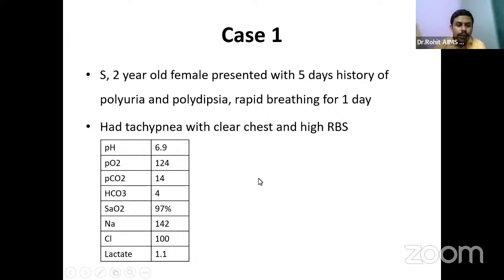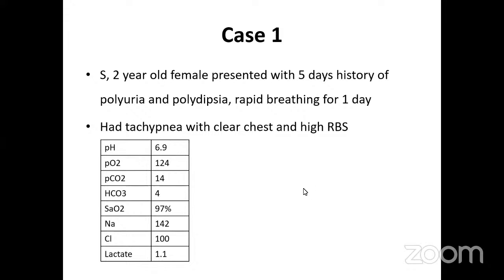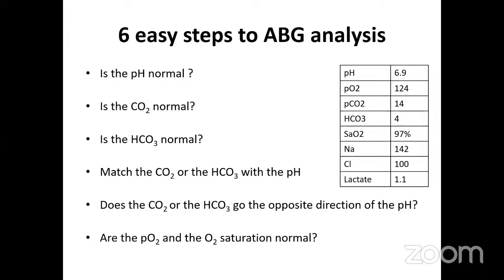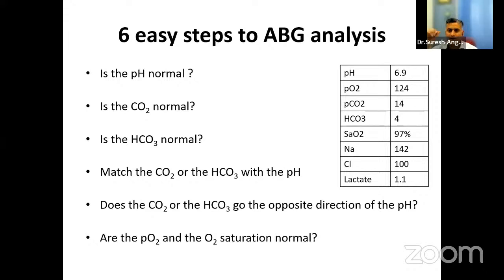Someone says severe metabolic acidosis, from Shubhasi Saldar. Okay, all right. Metabolic acidosis with respiratory compensation. Dr. Dibba has answered. Yeah. Severe metabolic acidosis with respiratory compensation. Narayana has answered. Yeah, very right. So metabolic acidosis with compensatory respiratory alkalosis. Many answers came. Yes, yeah. So that's a right answer.